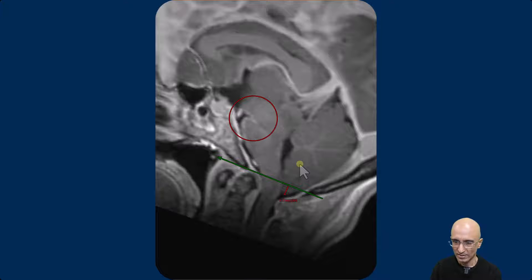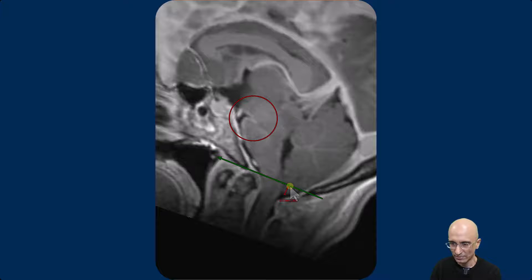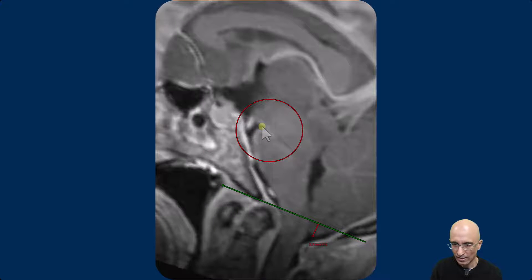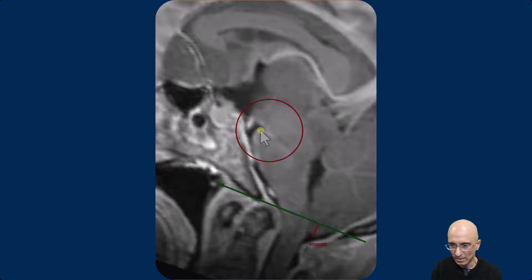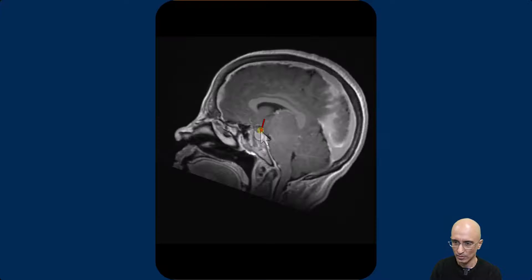On the sagittal midbrain images, you can identify the tonsillar ectopia. It's almost six millimeters below the Basion-Opisthion line. And if you look at the distance between the mammillary body to the pons, it's narrowed. The angle between the pons to the midbrain is also narrowed.